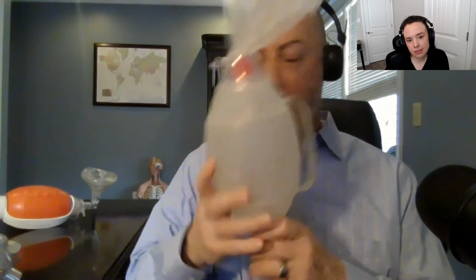Yes. When this first started being taught, if you purely look at the numbers, an adult BVM is 1,500 mLs, and the pediatric version is 500. Well, as a 5'11 male, you only need to give me 450, so the pediatric BVM is perfect. Not the case, because even if you squeeze it all the way, you're probably not getting more than 350 to 400. But the other issue is the amount of volume sometimes needed to fill the lungs.